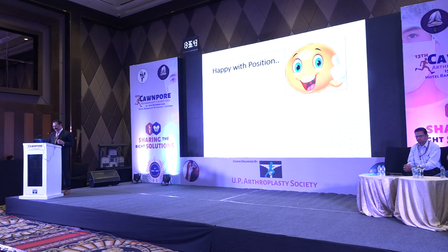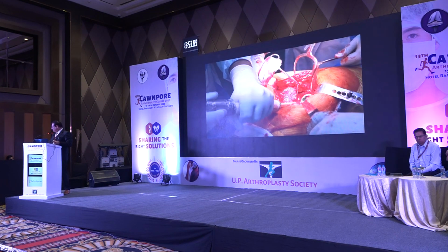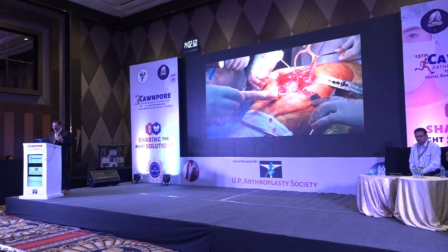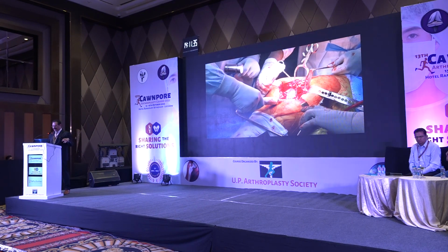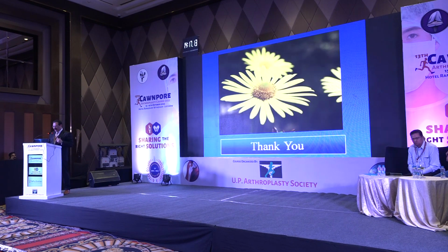Once you're happy with the position, you need to be sure on table: have I fixed my cup well? Is it rock solid? Is it strong enough? Just a small video to share with you. When you fix the cup, you follow the sound. Is the sound there? It is not there. As you reach the floor, the sound changes. And once you are happy, try to move it. It should not rock in the socket. The pelvis should move. And once you try to rotate hard, it should not rotate. This means you have got at least 3-point fixation and your cup is rock solid. You can add an additional screw if you wish, but your cup is rock solid. Thank you very much.